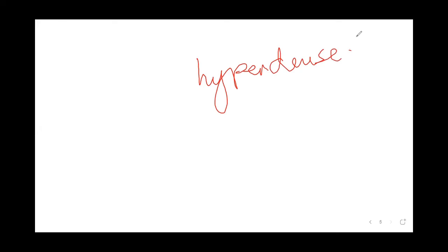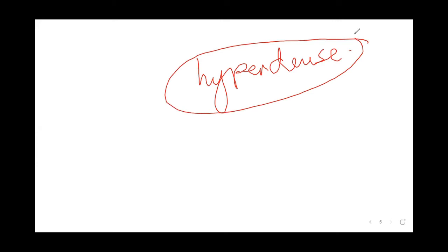Now, that accumulated blood will gradually lose its iron, because the body tends to reabsorb the iron content of that accumulated blood. So that hyperdensity gradually reduces.